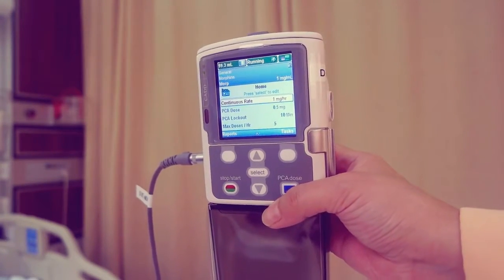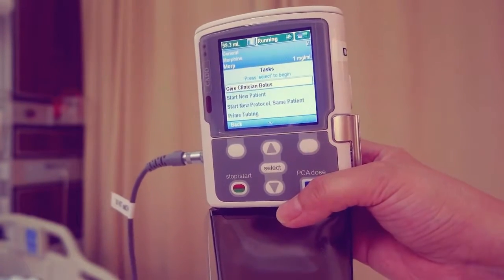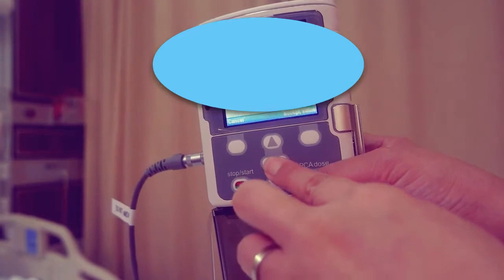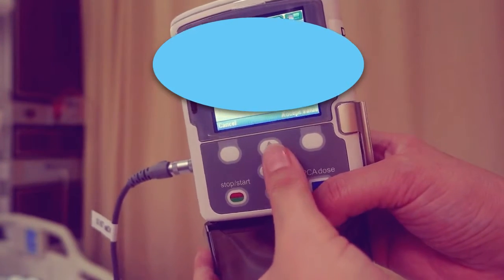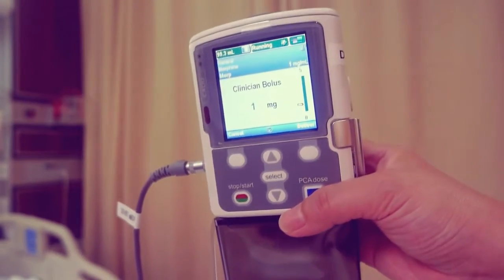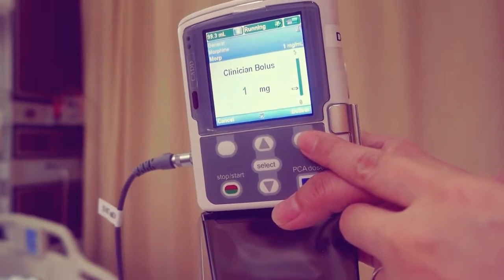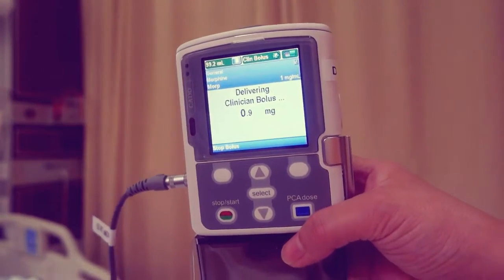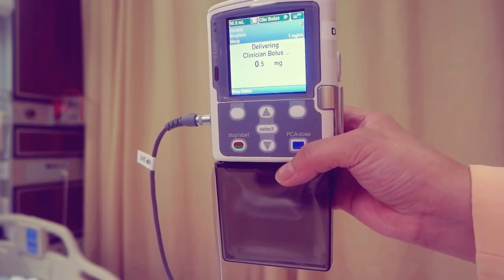The pump must be running when giving clinician boluses. From the home screen, press task. Give clinician bolus displays. Press select. Enter the clinician security code. The screen displays the clinician bolus scroll range available. Scroll up or down until the desired value appears, then press deliver. Choose stop bolus anytime during delivery to cancel the bolus.